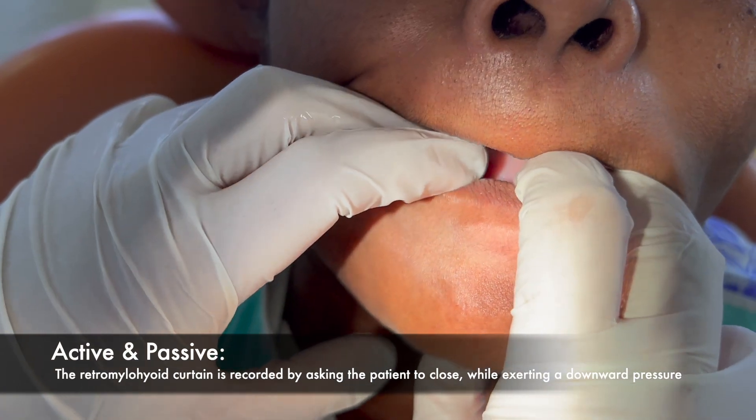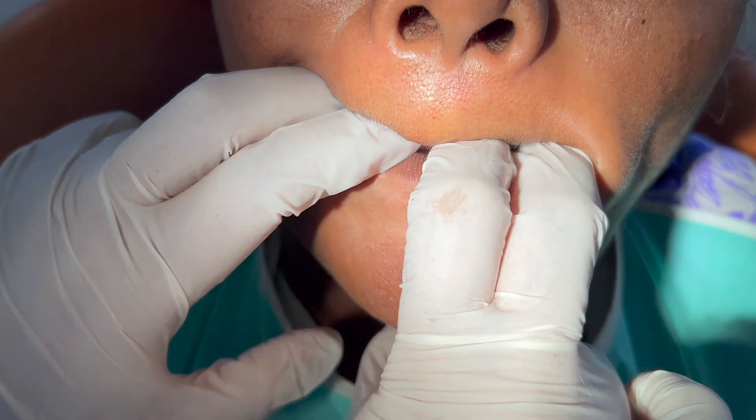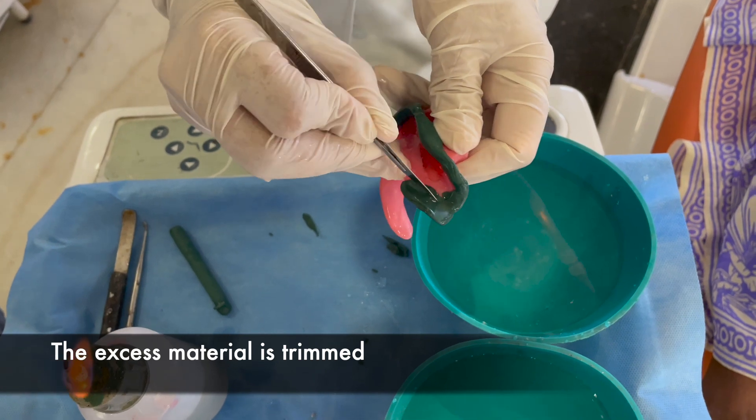The retromylohyoid curtain is recorded by asking the patient to close the mouth while exerting a downward pressure on the tray. The tray is then removed, the compound is chilled in cold water, and any excess is trimmed.